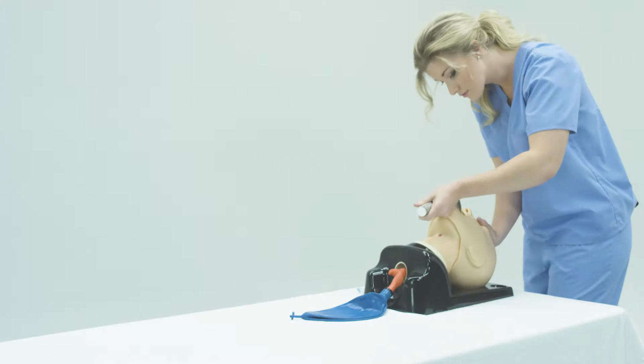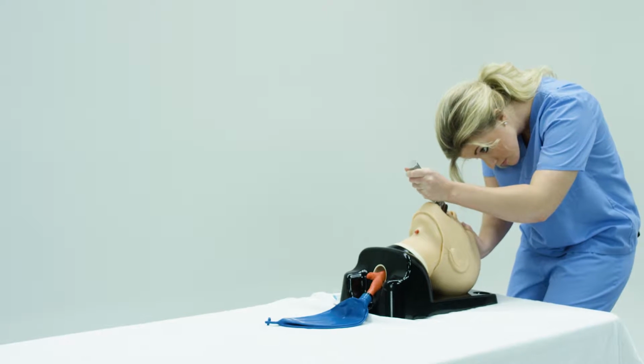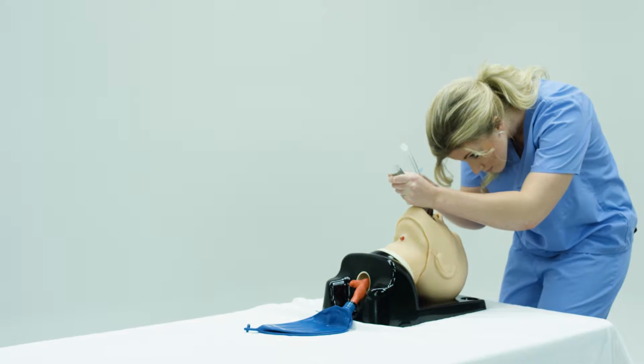Intubation is the process of passing a breathing or endotracheal tube through the mouth between the vocal cords and into the windpipe or trachea to ventilate the patient. This is usually performed with a standard anesthesiologist laryngoscope, a common device used by physicians during surgical procedures, by emergency medical services in the community, and even medics on the battlefield to secure a patient's airway.